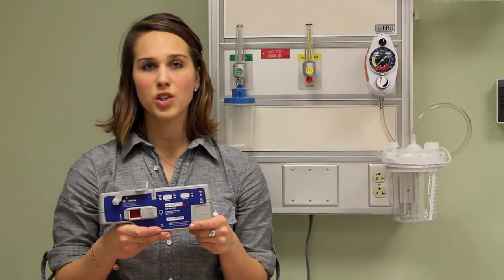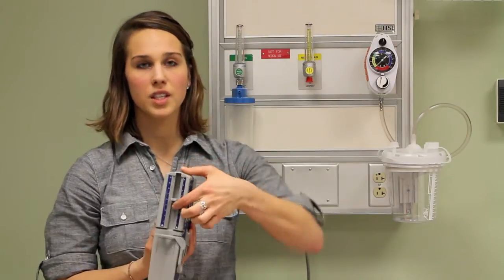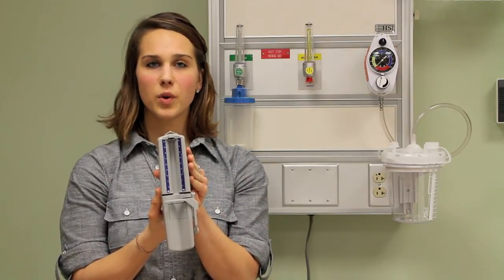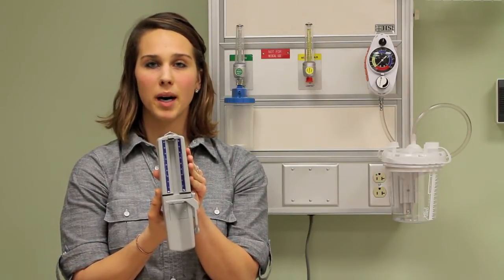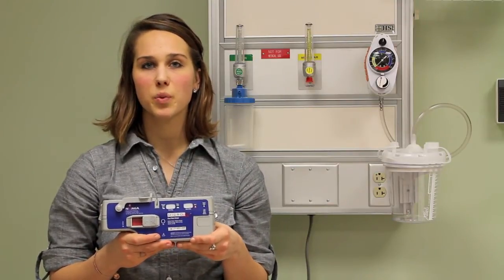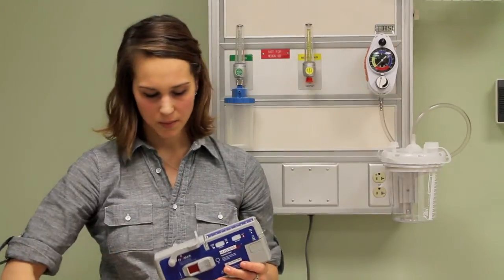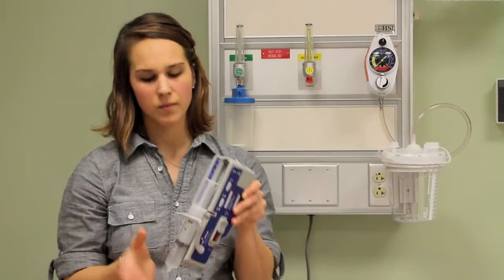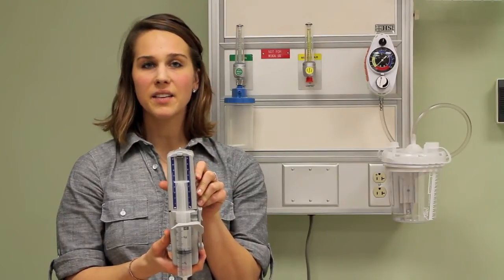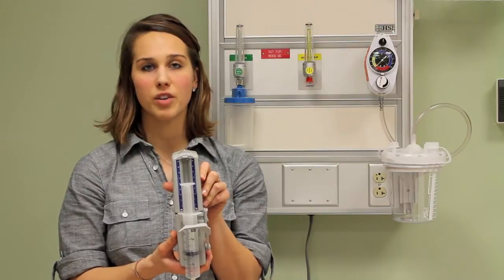To load a syringe, make sure the power switch is set to off. Slide the syringe driver arm to the top of the pump — it won't move if the power is on. Do not force the arm as it will damage the pump. Lift up on the syringe holder and set the syringe into the syringe flange slot in the middle of the pump, and lower the arm back into place. Finally, move the syringe driver arm to meet the syringe and set the syringe flange into the slot on the driver arm.